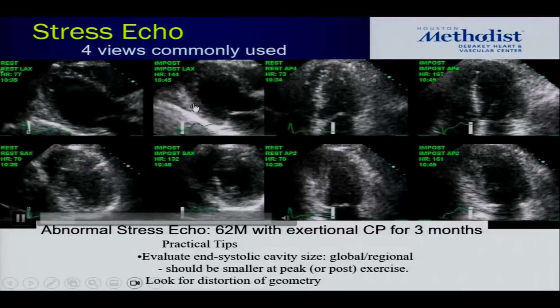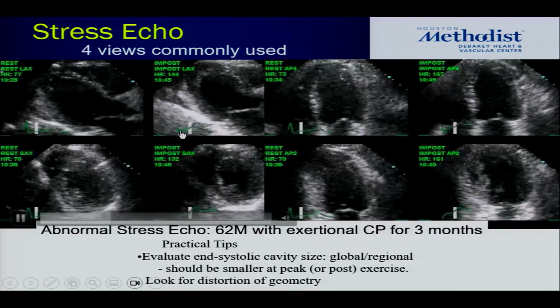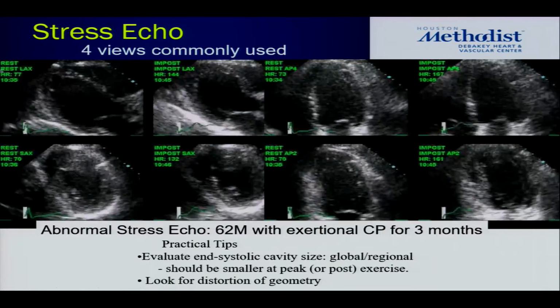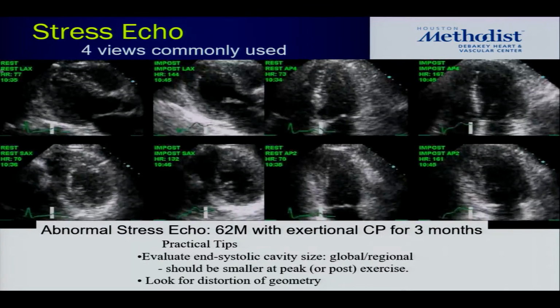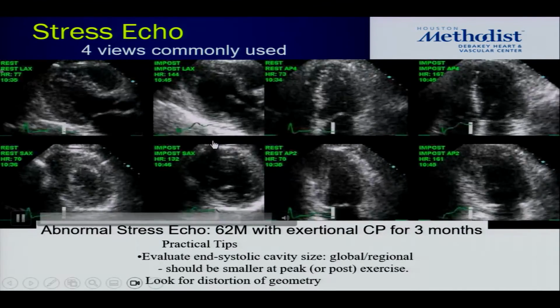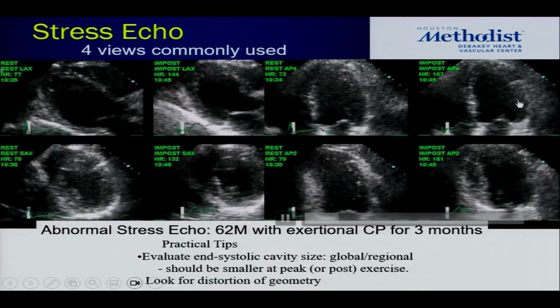Always important to take a look at the EKG and make sure that you still have a nice, good, narrow QRS and you're not dealing with a PVC. Sometimes, if somebody's having a lot of PVCs, the system can acquire a PVC beat, and obviously that would take you to a whole different ballgame in terms of your assessment.